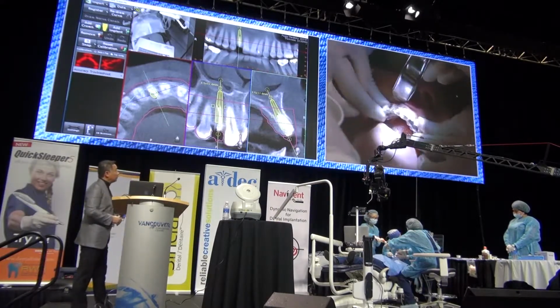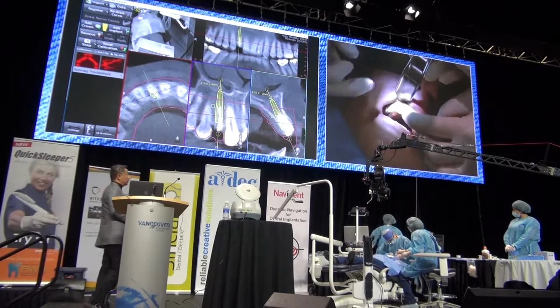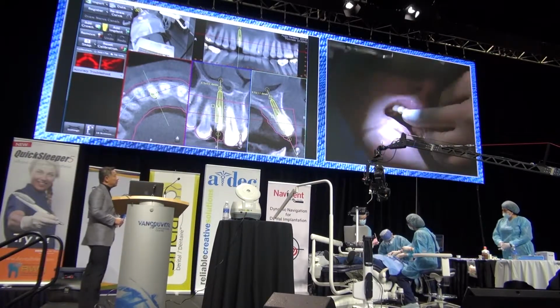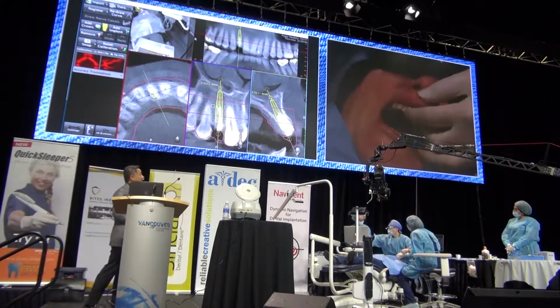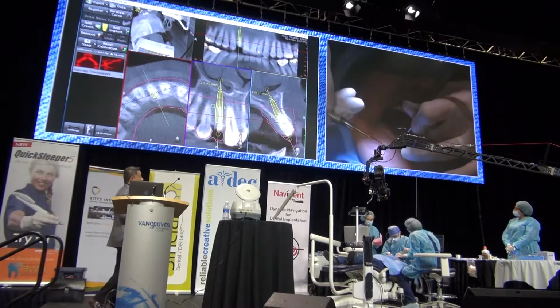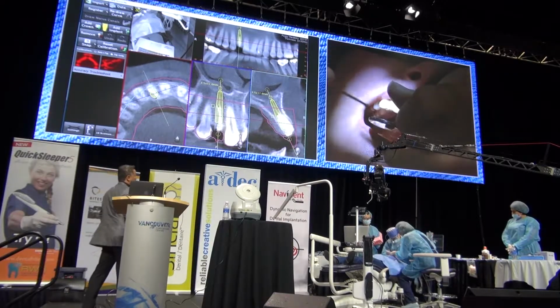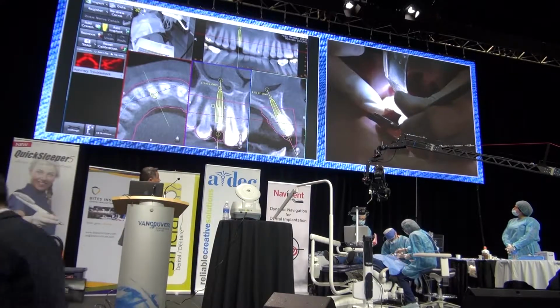So this is a shell that's been pre-made from the wax setup, and we just line the material over this. So it indexes to the rest of the mouth, and we just let the material set. You can remove the excess and or get access to your screw retain scenario. So once the material sets, you can have access to your screw, and once we remove it, the lab will do the rest in terms of finishing the contour of the emergence.